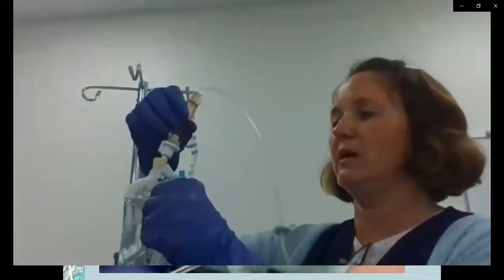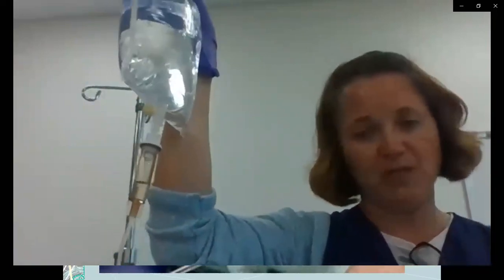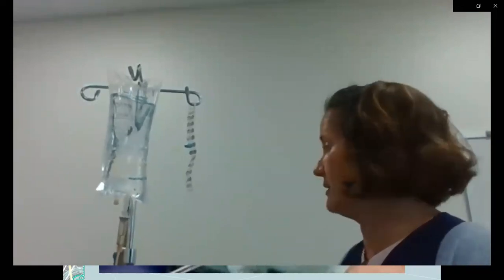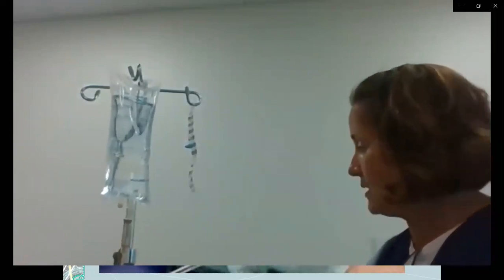I'm going to have a little bit less. Okay, all right. So now I've got my drip chamber back how I want it to be. So don't freak out about it. As long as you don't contaminate the line, pretty much anything else can be dealt with when you're starting your IV fluids. So don't panic if you do something wrong. We can fix it.